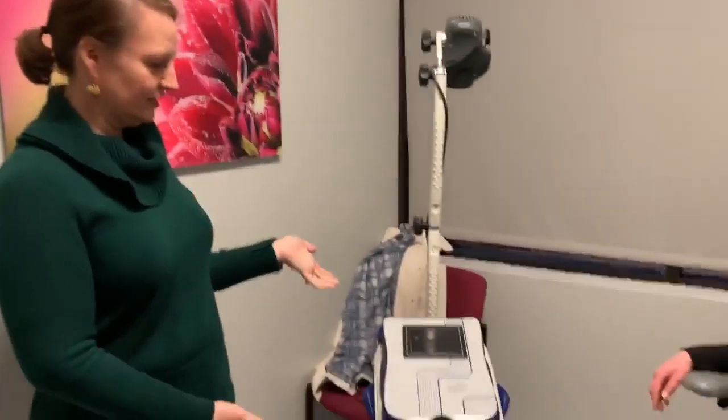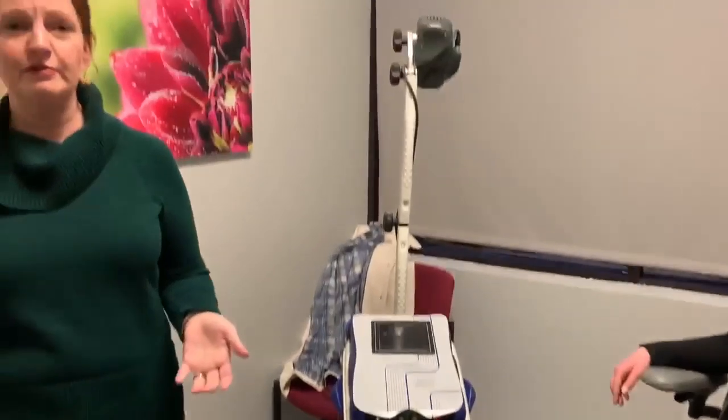Hey guys, it's Dr. Carter here at Lexington Podiatry, and we're going to show you about a great new tool we have in the office. It's our new MLS pain laser, and this is a laser that we use for a bunch of different conditions in the office.